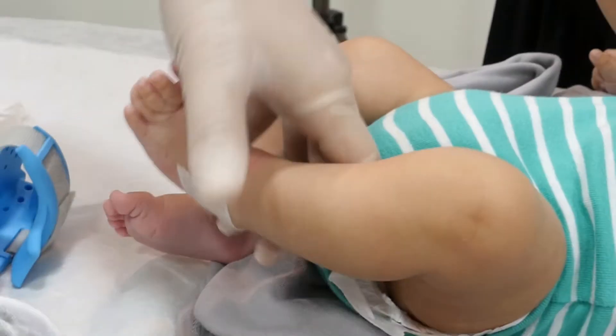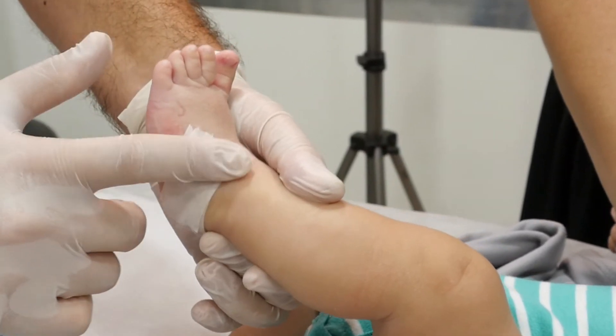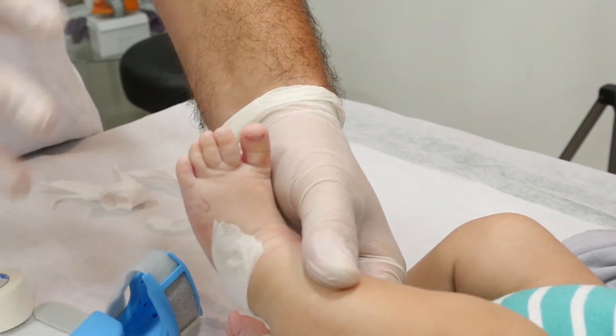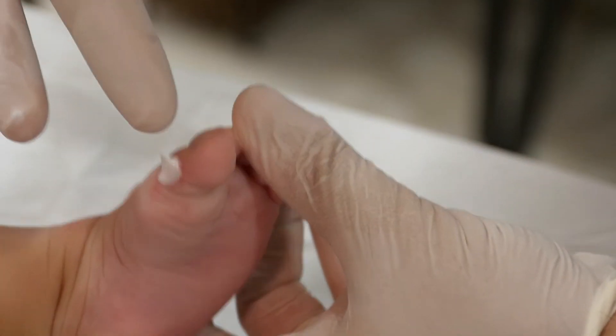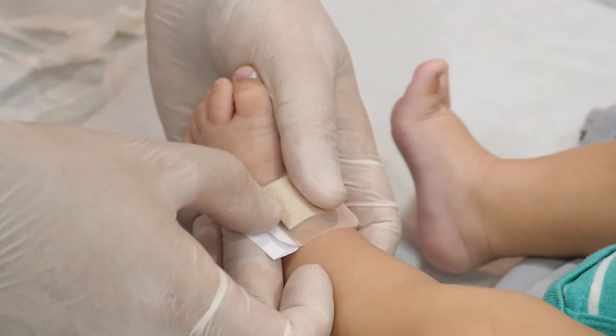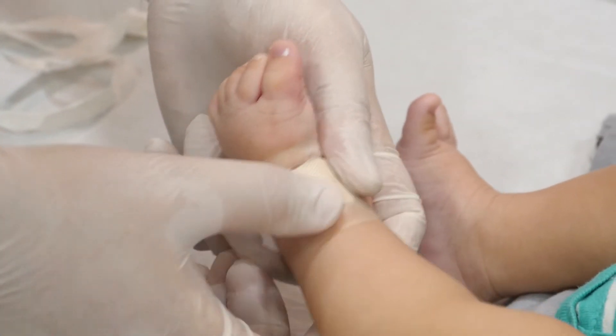If bed sores or blisters appear on the baby's foot — a problem that occurs mostly due to over-tightening of the strap or improper setup — therapy must be stopped for about 2 hours. Anti-irritation cream for the skin should be applied on the area, and then the area should be covered with a band-aid. After 2 hours, therapy should be continued regularly.